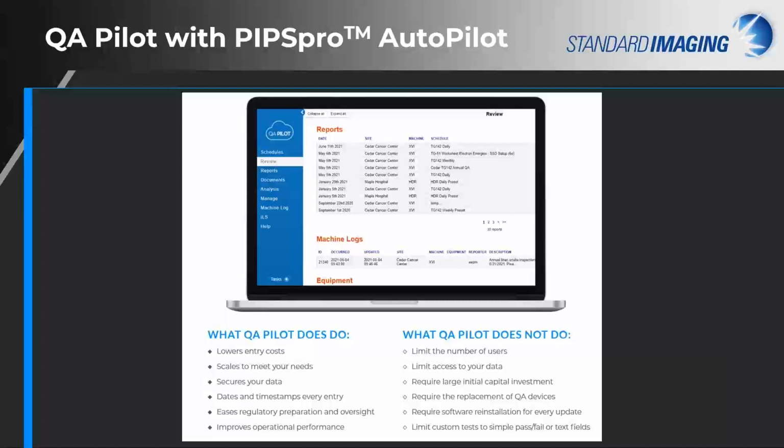It allows you to help improve patient safety by providing clinicians with necessary oversight tools of QA documentation, processes, and communication. It will save you time by providing automation tools for data import, image analysis, and again, that ever important departmental communication.